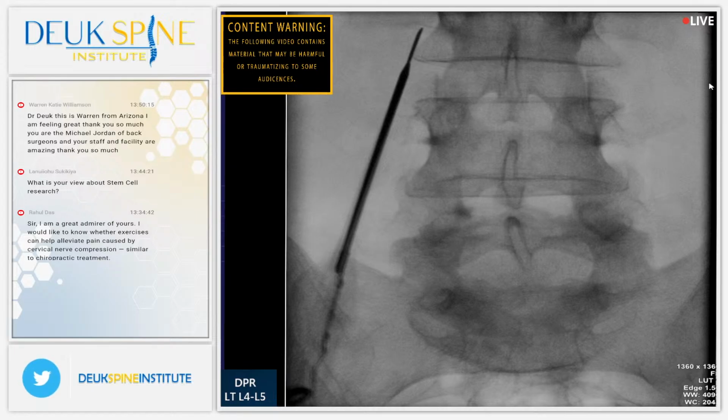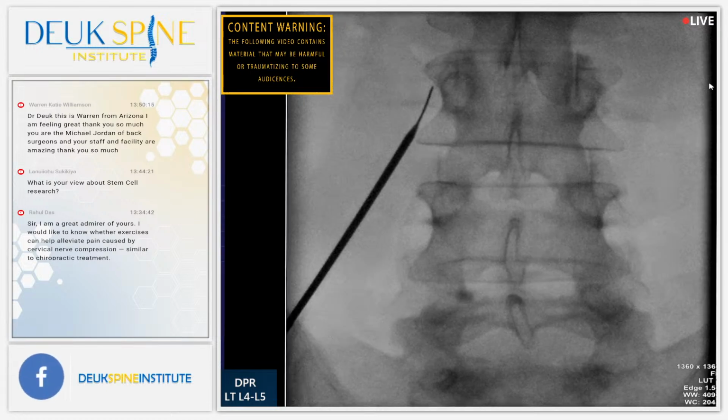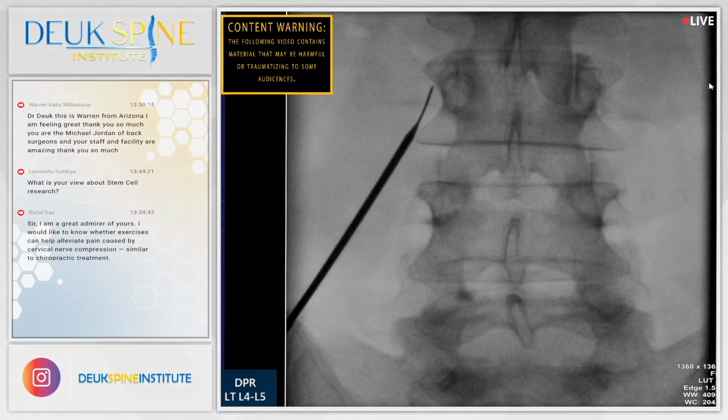I need you to go a little north. I'm trying to get one extra facet up there because I think I need you to move north a little bit because he's having pain a little higher. So I think it's higher. I want to make sure we get everything. All right, let's show the audience how we treat facet joint pain. All right, can you do that, Henry? Of course.